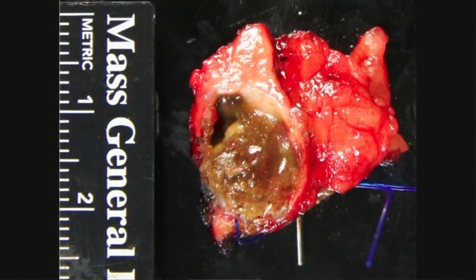On this next slide, you can see the gross specimen that was identified in pathology. You can see a thickened cyst wall with mucinous and thickened debris within the cyst. Also, normal pancreatic parenchyma can be identified.